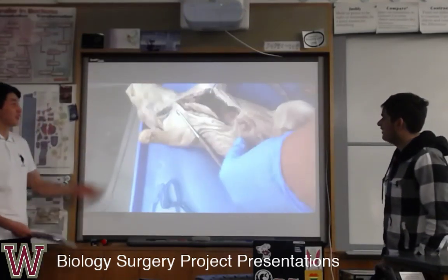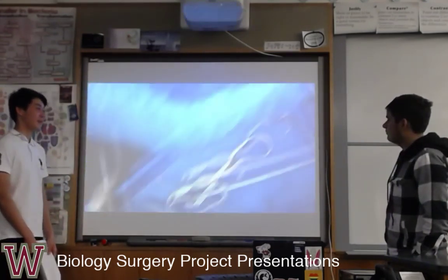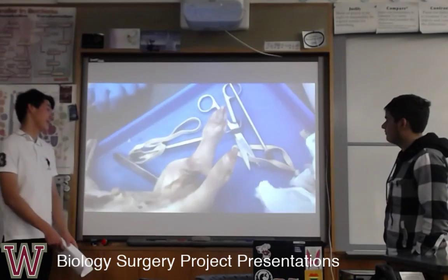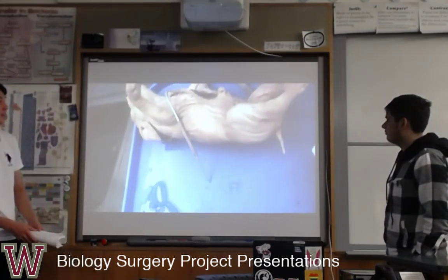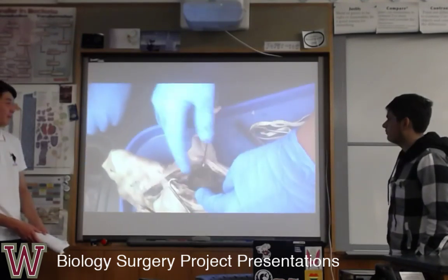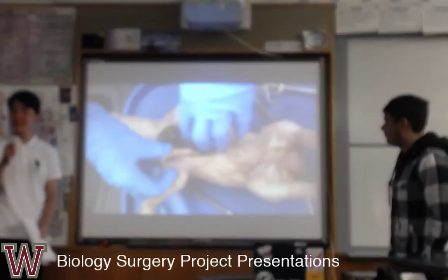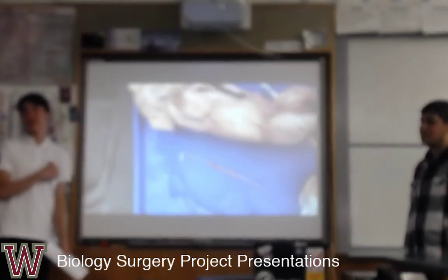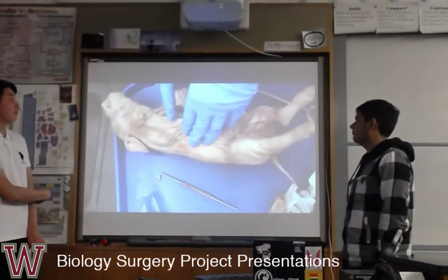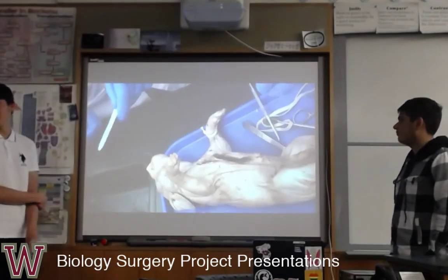Now we clean out all the liquid from the pig. We can imagine that's blood. And then we have a new heart in, and we put it back in the pig. Then we use special thin stitches that can stay in your body forever and just dissolve. So then we sewed it back together, so you don't have to take them out anymore and you don't have to do any more surgeries.